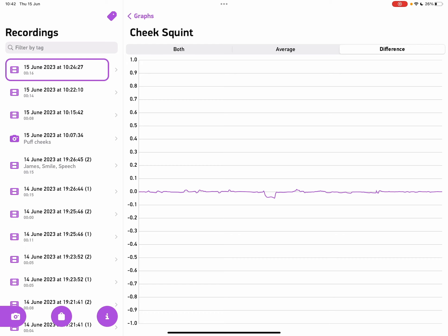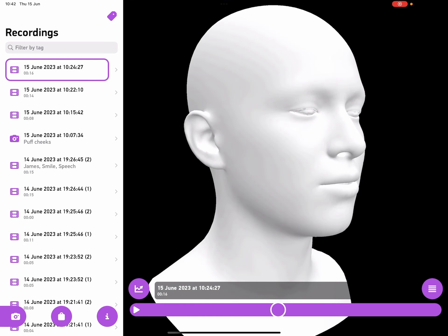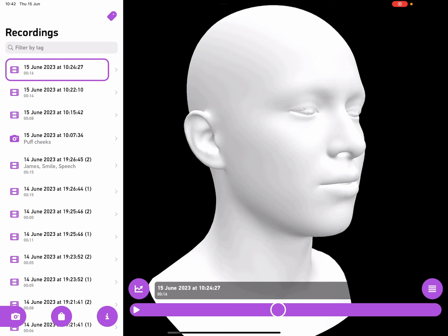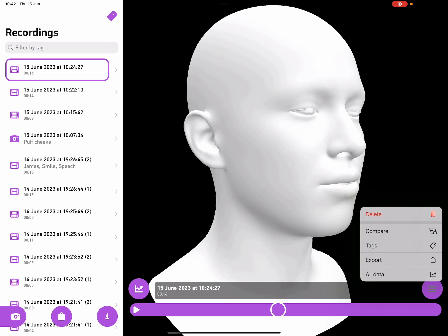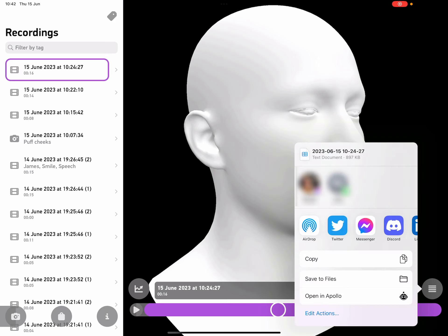I'm now going to go back to the graphs and back to the replay, tap on the menu again, and this time tap on export. This will export the data in the recording as a CSV file, which I can open in any spreadsheet I like for further analysis.